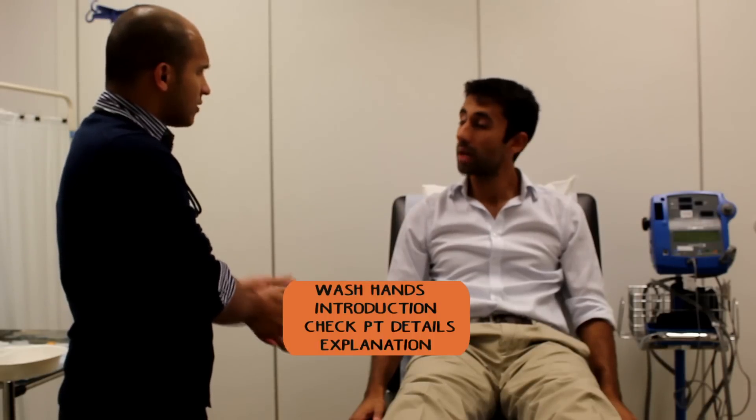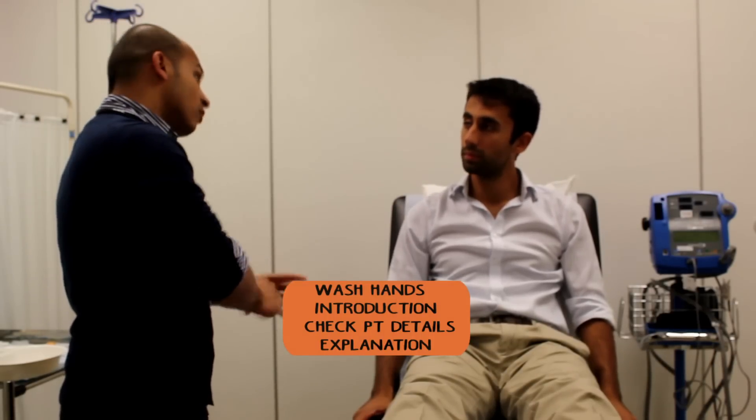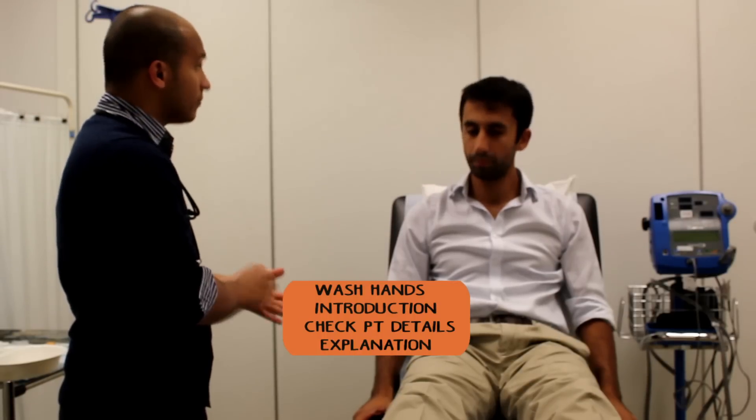Have you ever had bloods taken before? Yeah. Which arm do they normally take it from? The right one. Okay. It just involves me putting a small needle into the crook of your arm and taking some blood. Okay, no problems.